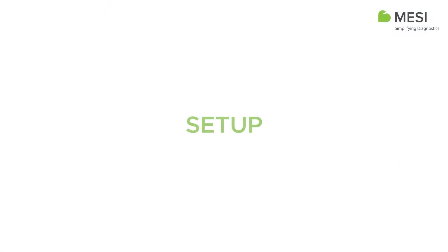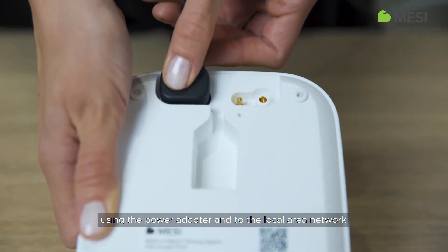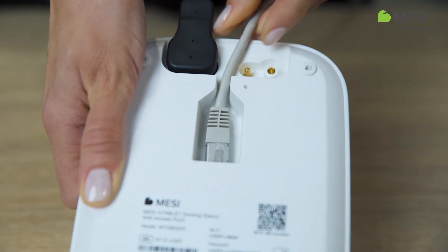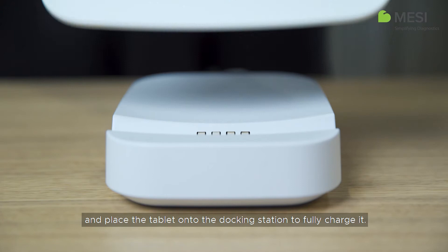To start using the tablet, connect the docking station to the mains electricity using the power adapter, and to the local area network using the network cable. Remove the shipping mode sticker and place the tablet onto the docking station to fully charge it.